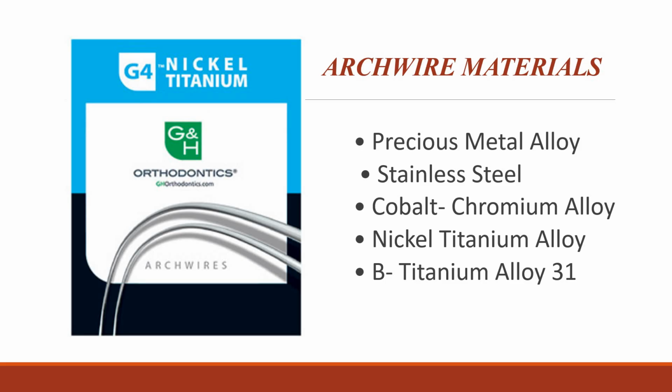Arch wires. The original arch wires used in orthodontics were made of gold, but metallurgical advances have meant that a wide range of metal alloys are now available.